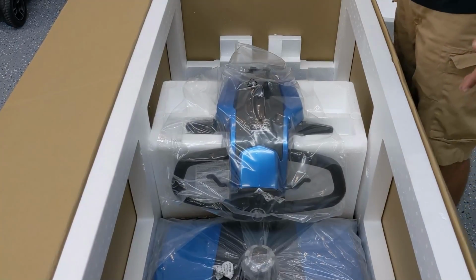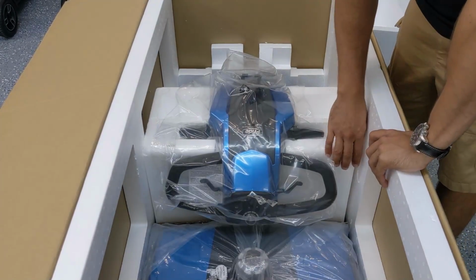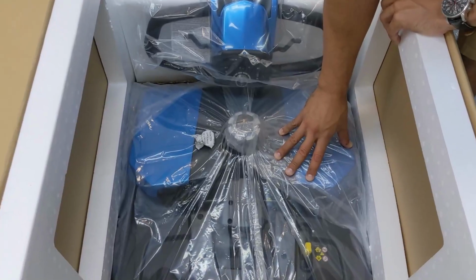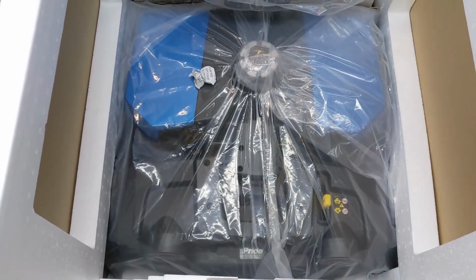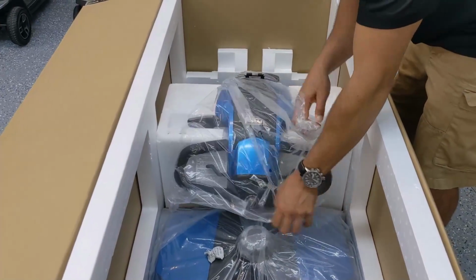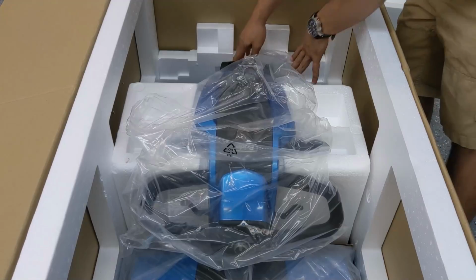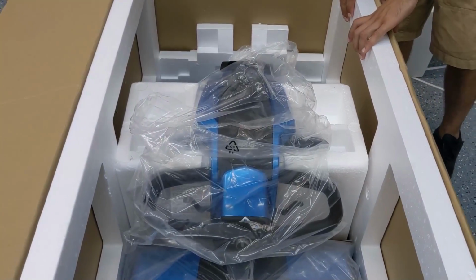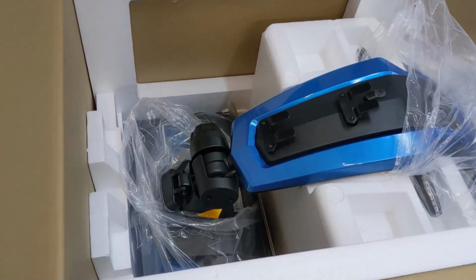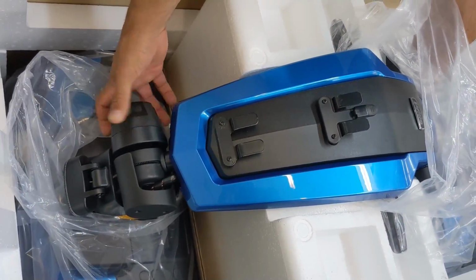So now that we've taken off the styrofoam molding and removed the first few parts, we can see that the tiller is here exposed, as well as the base of the scooter. So I'm going to go ahead and now begin to take off the plastic from the shroud so that I can access the tiller adjustment knob, which is basically what allows you to raise and lower your handlebars on your scooter. It's very common to see this type of mechanism.